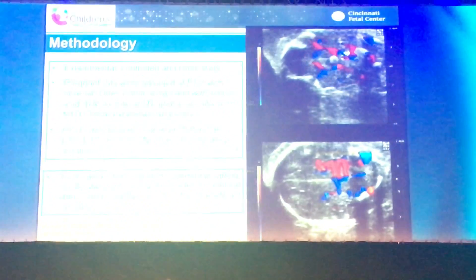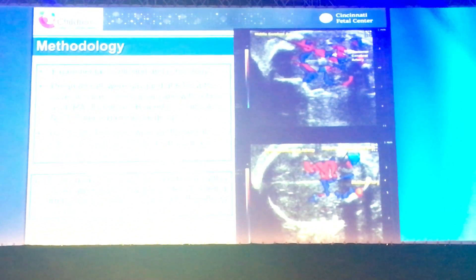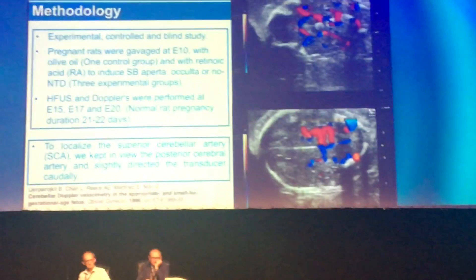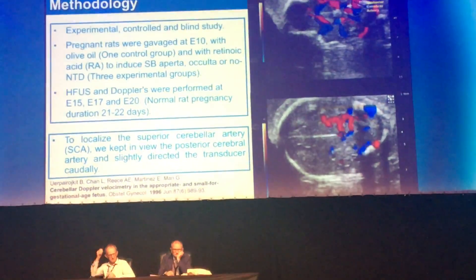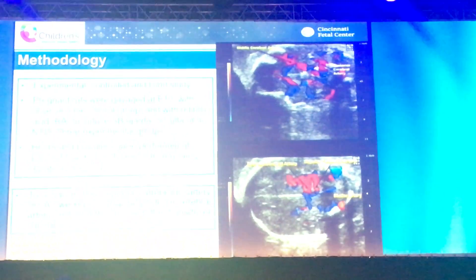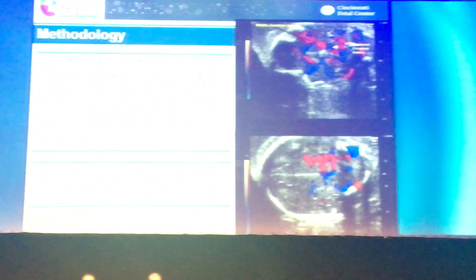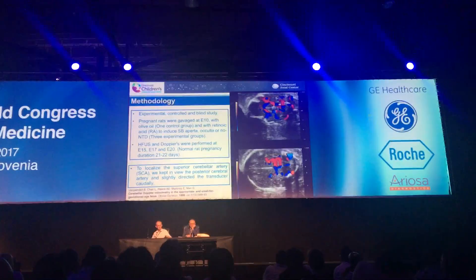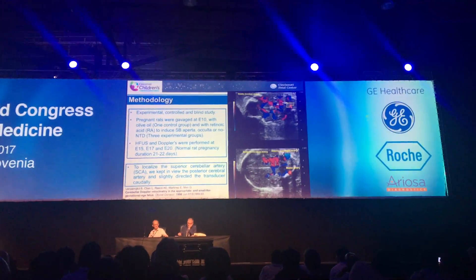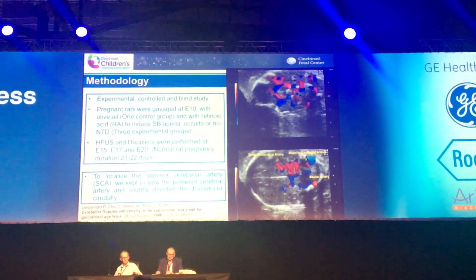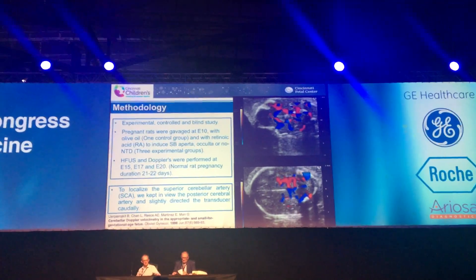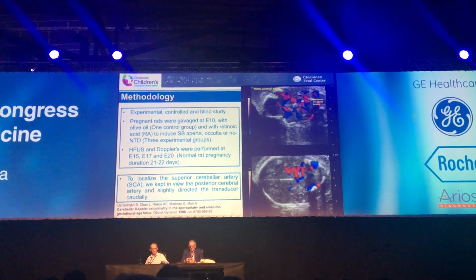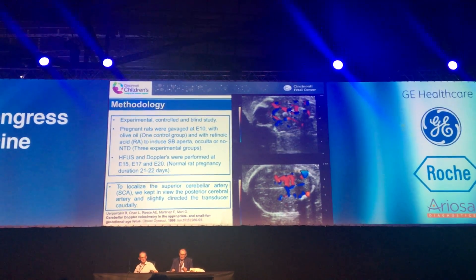In the first video, the first thing we need to do is identify the circle of Willis. Once we identify the circle of Willis, instead of paying attention to the middle cerebral artery as we usually do, we pay attention to the posterior cerebral artery. Once we have identified the posterior cerebral artery, we slightly direct the transducer caudally, and we will see the superior cerebellar artery arising from the basilar artery, posterior and caudally to the posterior cerebral artery. The main vascularization of the cerebellum is through three arteries: the superior cerebellar artery, which is easily identified by ultrasound as a branch of the basilar artery, and the other two inferior cerebellar arteries, which are not easily identified by ultrasound.